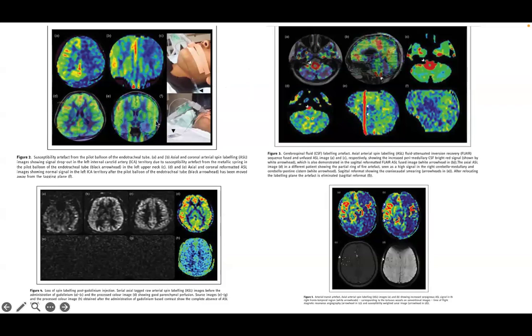center, and you see this artifact. So it is very technically demanding. Unless you are very careful, it can induce a lot of artifacts, and also the scanner homogeneity, everything has to be properly maintained.